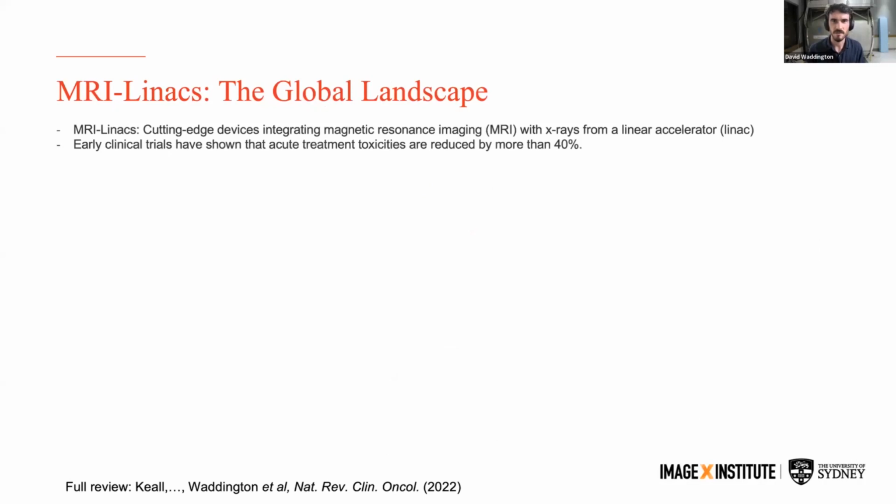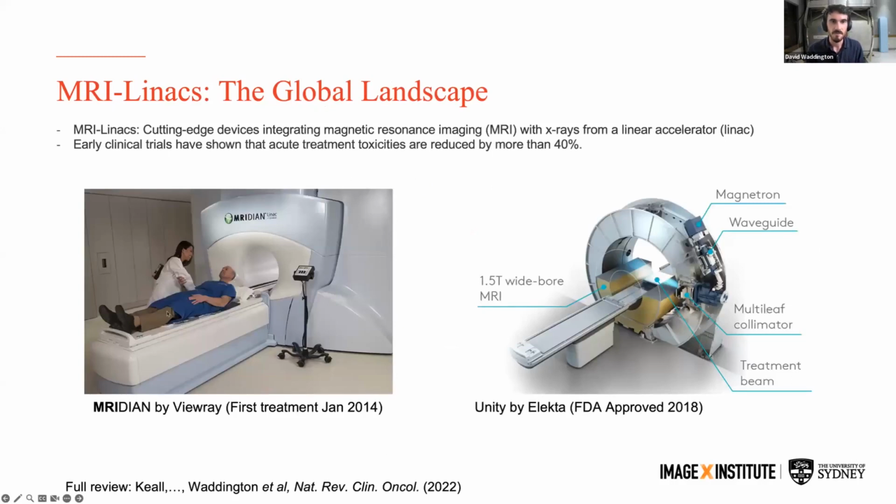Globally, integrating MRI with the linear accelerator, the Linac, has been done by a company called ViewRay, with their system, the MRIdian. They first treated a patient in January 2014. It was based on a cobalt source then, but has since been upgraded to a linear accelerator. And very recently, which I won't touch on, there was a bankruptcy for that company. But things are still great in the MRI-guided radiotherapy world. Let's keep that smile going.